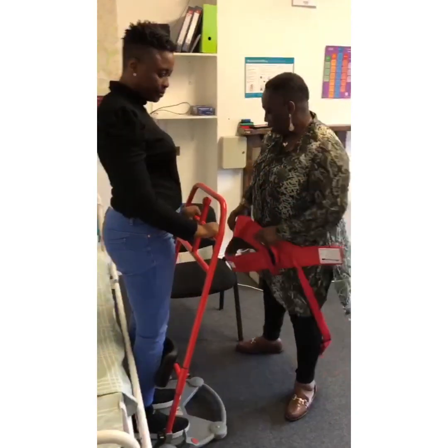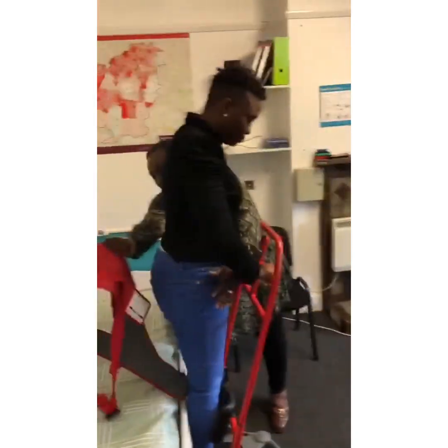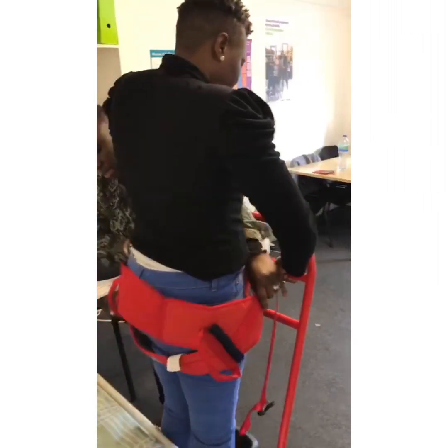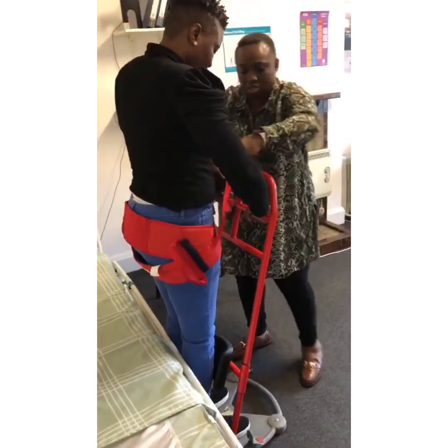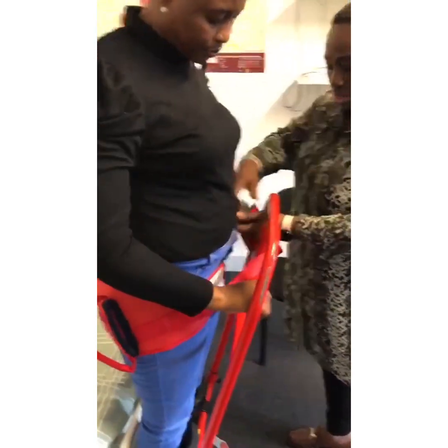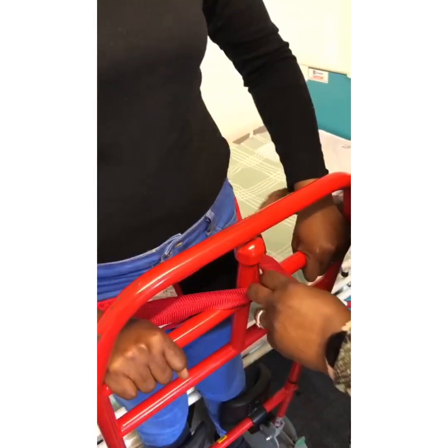We move this out of the way, strap her in — put the velcro here, that's good — then take the strap and put it through the little rod by the bar, and click it in. It has to be tightened enough to hold her steady. Are you okay, darling? Good.